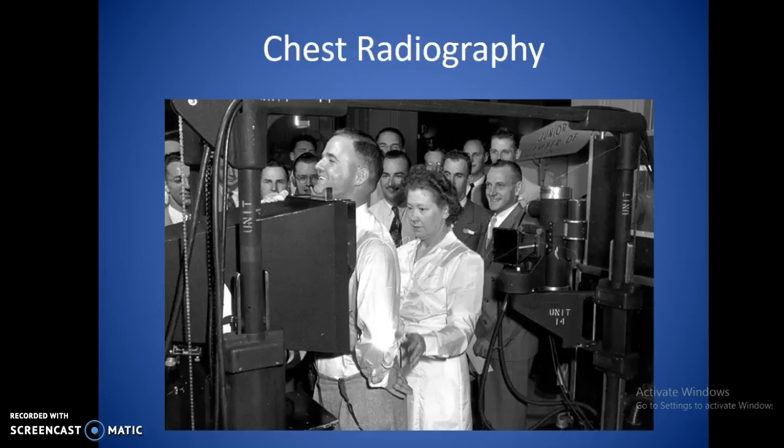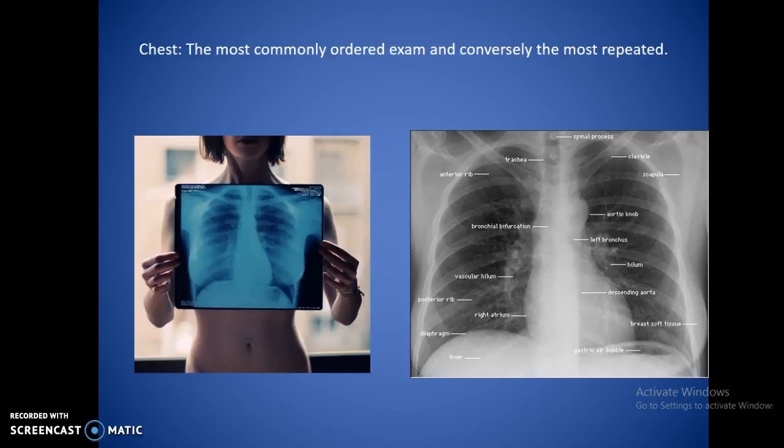Alright, we're going to get started by going over some of these PowerPoints. I'll have a short video kind of overlay with some audio just to help key you in on some important parts and maybe some interesting facts or things you need to focus on. Obviously today we're going to start with the chest x-ray.